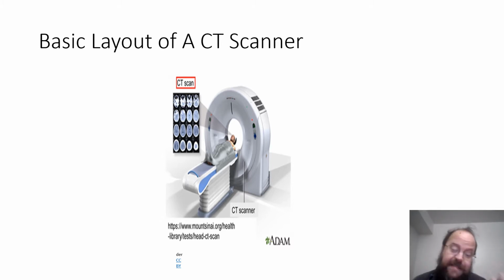They're basically a CCD camera, the receivers, except they're tuned to a different frequency. Remember, X-ray is still light, and so a CCD camera can pick it up. The major difference is that it has to be resistant to the penetrating nature of X-rays, and the patient lays on the table and they're put through really quickly, and so that's what you see here, a simple diagram of a modern CT scanner.